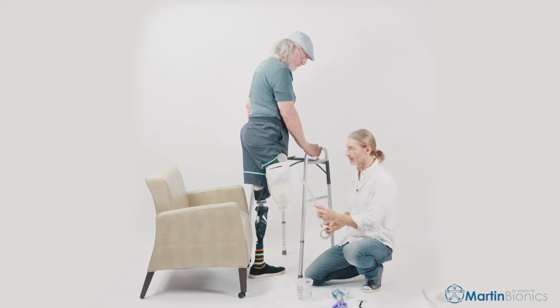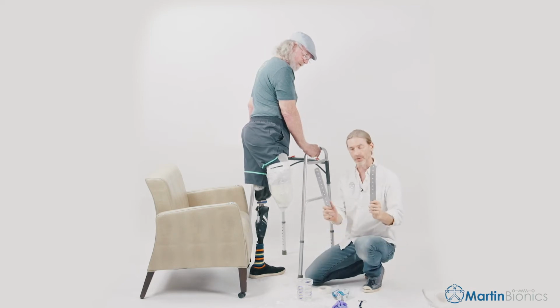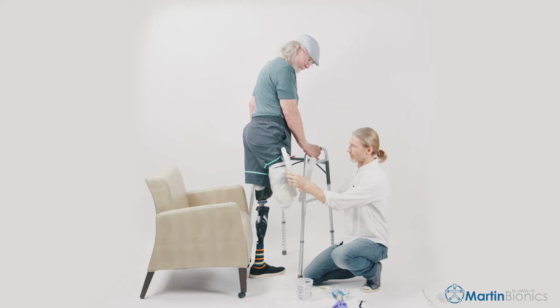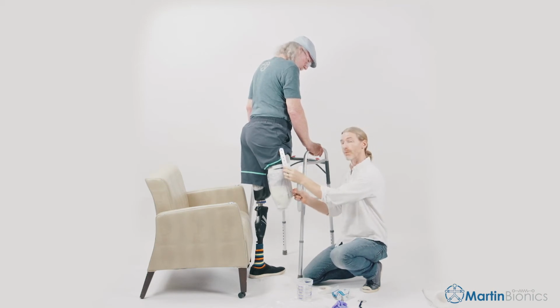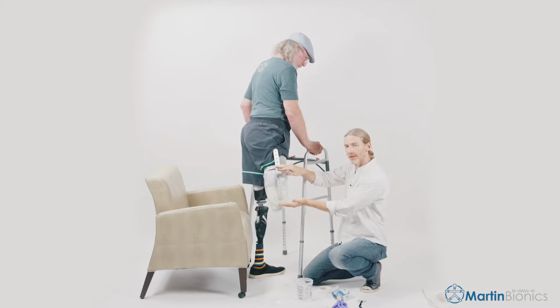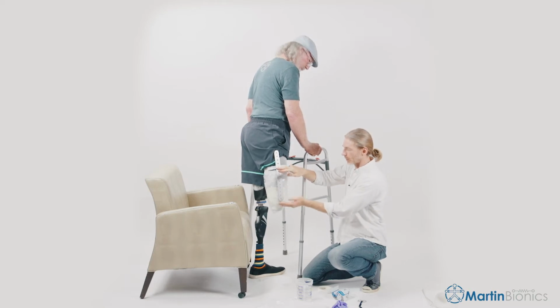So this next step is I'm going to add in our 2 lateral struts. These are aluminum struts. We've cut these to length. I wanted to have these so that the proximal end of the posterior lateral strut sits just posterior to the trochanter and proximal maybe an inch, and then running straight down the length of the limb. We want this to come pretty close to the end of the limb length. With this long of a limb, we can cheat up a little bit, but in general, we want this to come as long as possible.